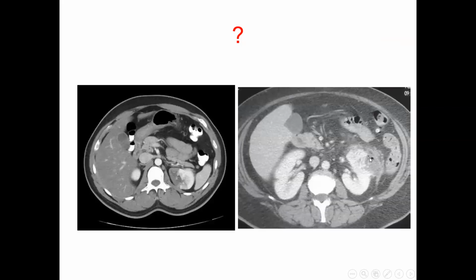This is a kidney where there's an abscess inside. You see air inside. There's a speck of air here. So this is an abscess, and look at the fat around it. Perinephric fat stranding. Okay. This is an infarct. Remember, don't mix up the infarct with pyelonephritis. Striated nephrogram means triangular, patchy enhancement. Some part of the kidney would enhance, some would not enhance. Infarct means when the kidney doesn't enhance totally like this.